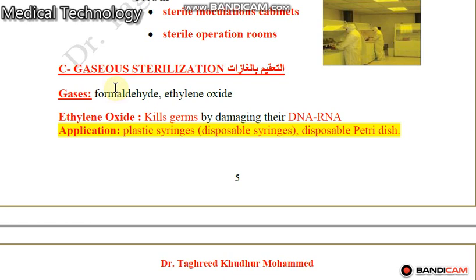It causes damage and inflammation in your skin, eyes, and respiratory tract. So you must wear PPE, personal protective equipment, when you use this type of gas to sterilize your laboratory or operation room.